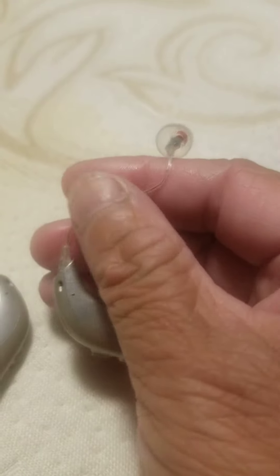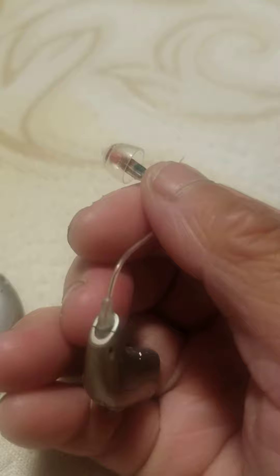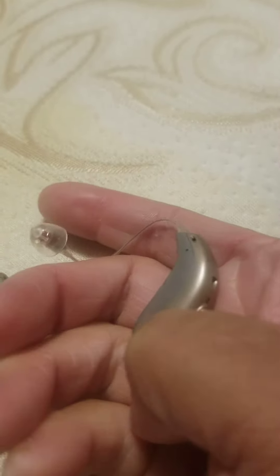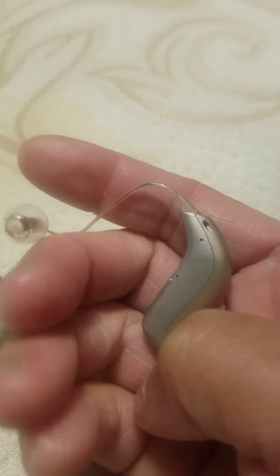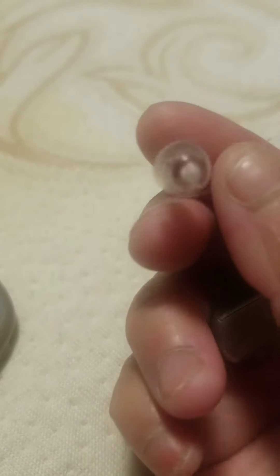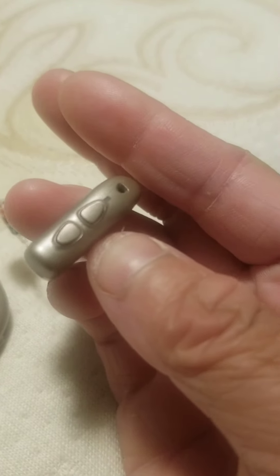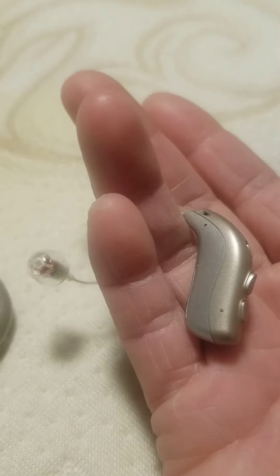It has a metal wire with a plastic cover, a plastic dome, and a heavy duty metal piece.